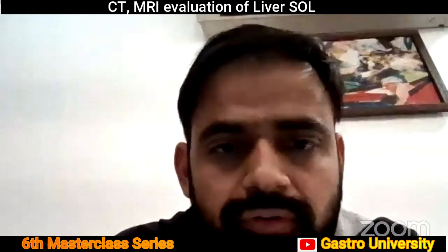Hira. Hello. Yes. So first I'm coming to Kapoor sir's question, that in which lesions we should go further for imaging after the ultrasound, and which we should stop.